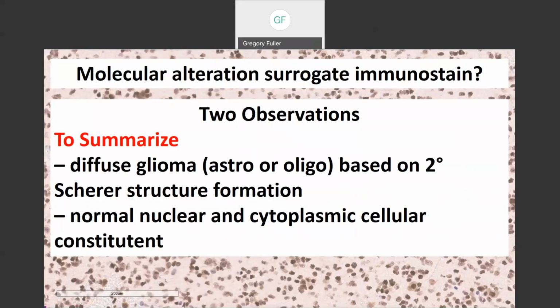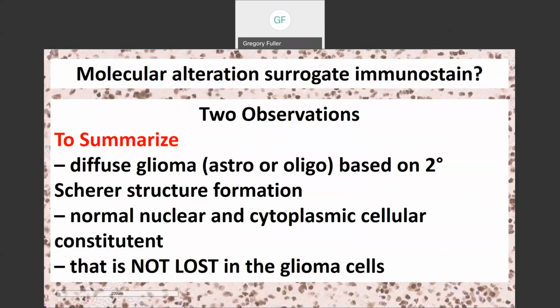Now this is a different Venn diagram sphere. If you wanted to break it down that way, for differentiation marker, for molecular marker, what are all of the immunostains that you can think of that should label an epitope, an antigen you're going for, in the nucleus and the cytoplasm? And there are a bunch of them. NeuN would be a great one for the neurons, right? It stains nucleus and cytoplasm. S100 protein is another good one. But NeuN obviously should not stain the tumor cells. All right, so the third piece, it's actually three observations.